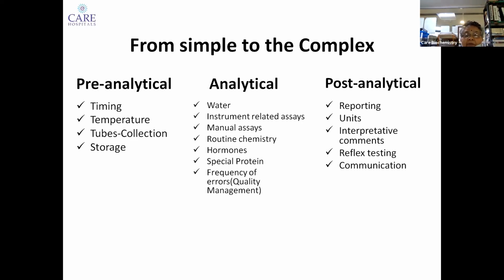And also the deterioration of the calibrator and controls is a challenge. So there has to be a dedicated staff or personnel who look after these things. Hormones are a problem by themselves. We have so many instruments and we feel whatever we put in and what comes out is absolutely correct. No, if we sit and ponder over our results along with the clinical history, then only we understand in how many processes we have gaps.